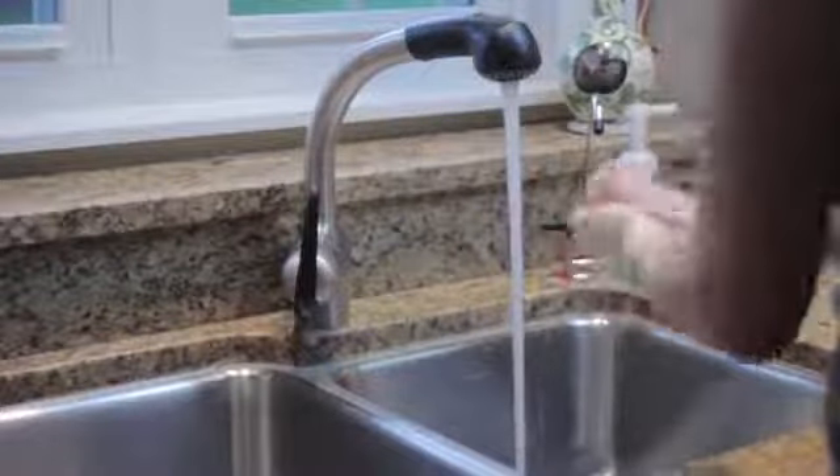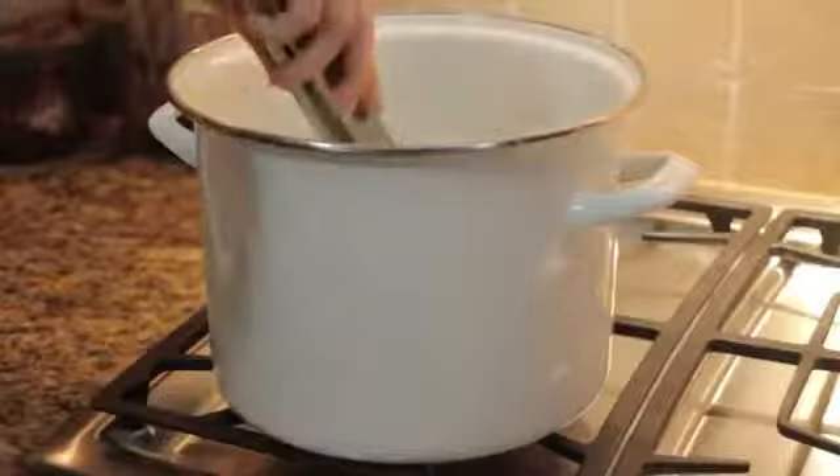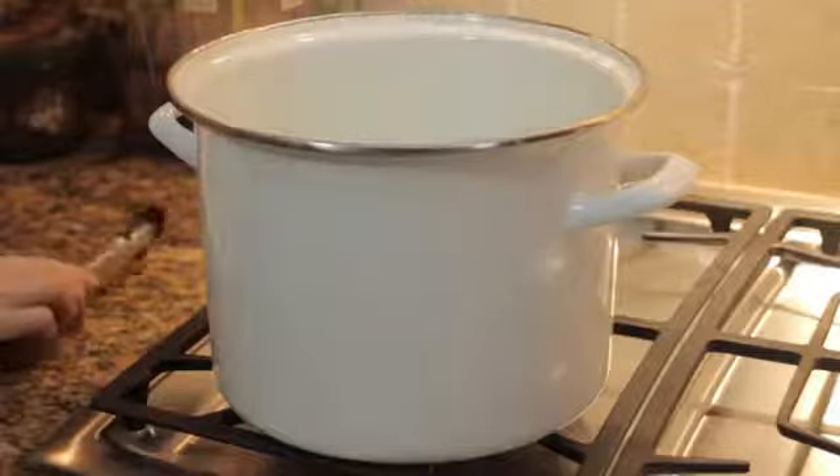Before you pump, wash your hands well with soap and water. If your pump is marked sterile, you may open and use it right away. If your pump is not marked sterile, boil all of its parts for 20 minutes to sanitize them. Then let them air dry.